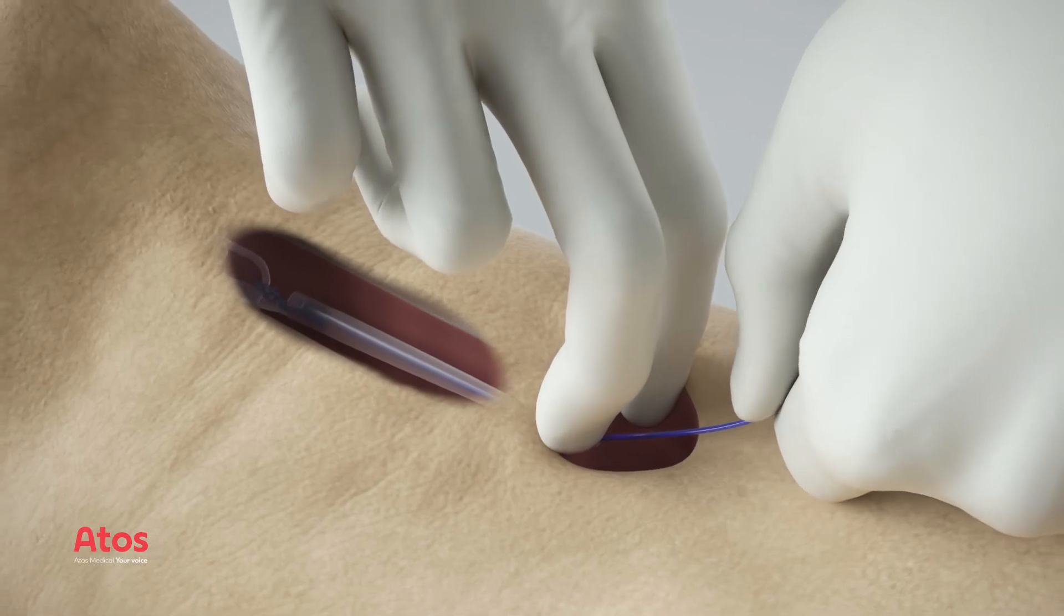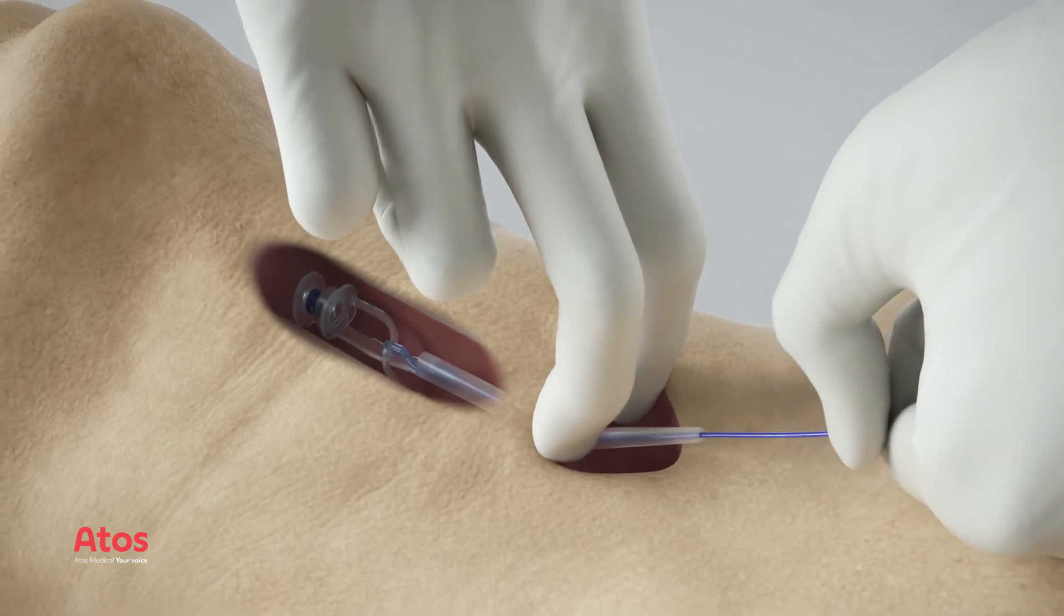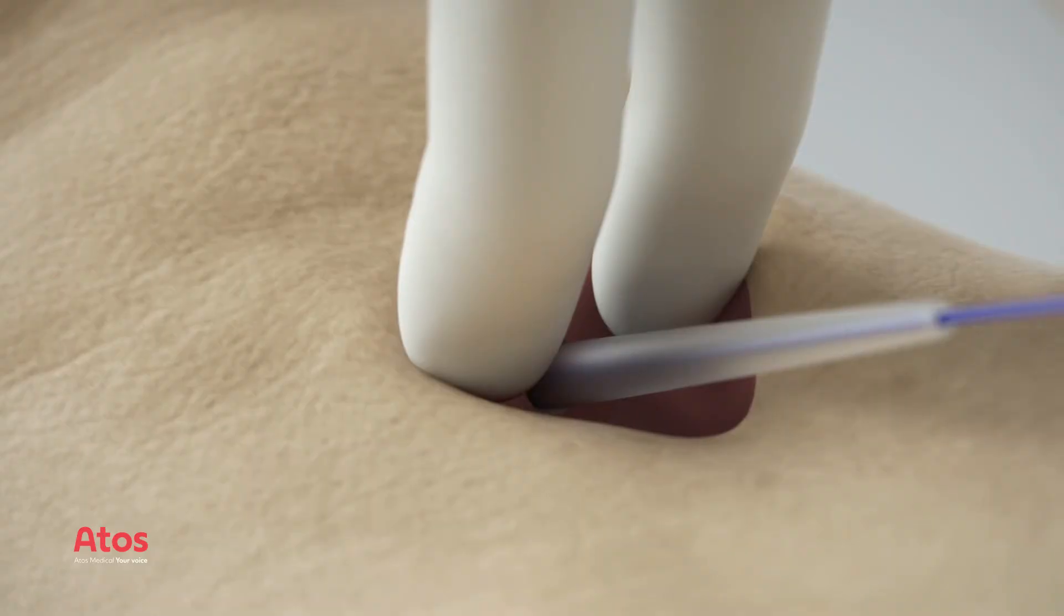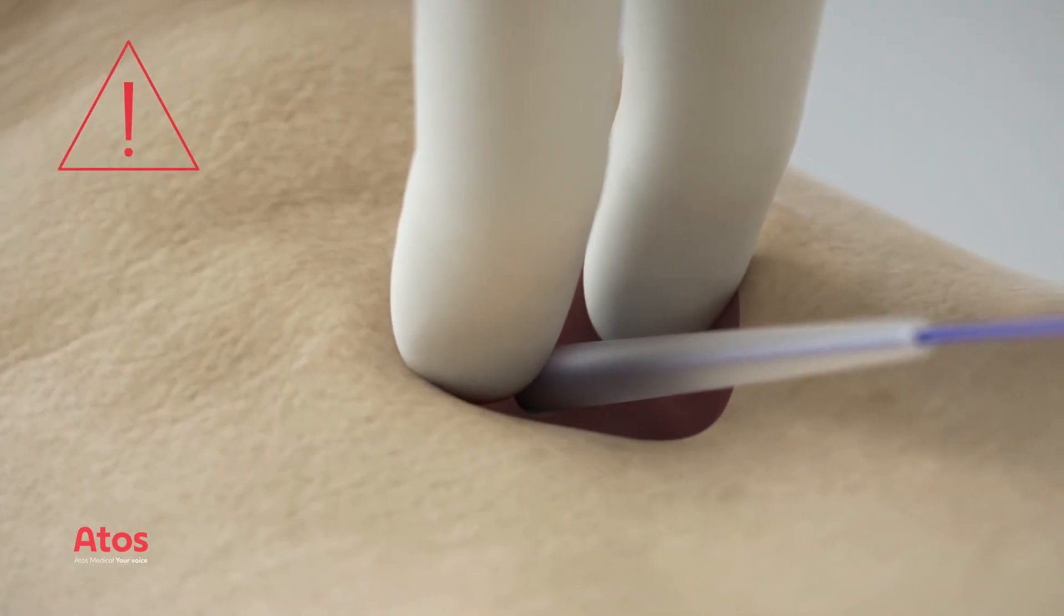Dilate the puncture site by carefully pulling the guide wire until the dilator has passed the puncture site. During dilatation, support the TE tissue to reduce dilatation force.